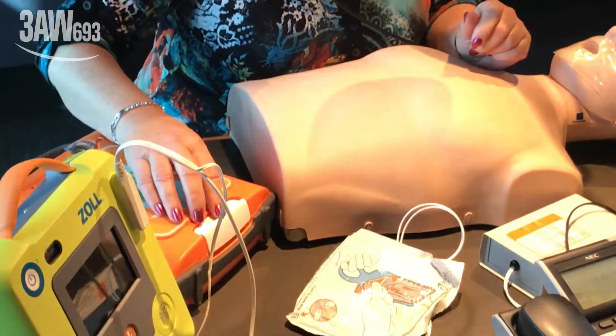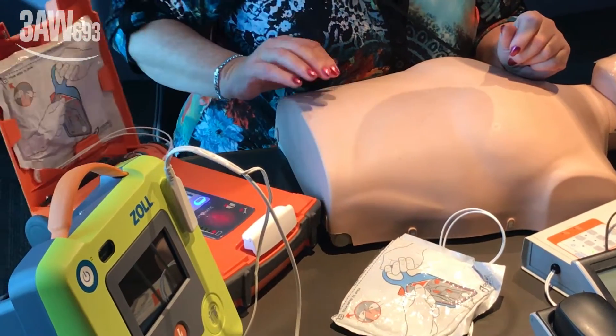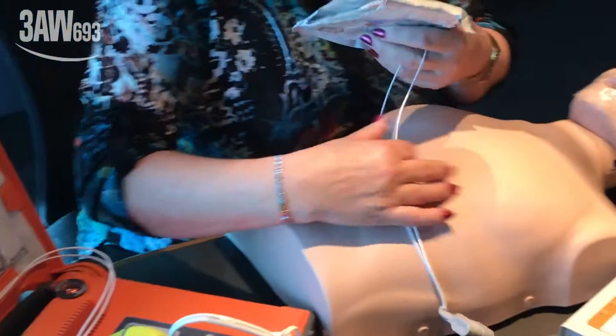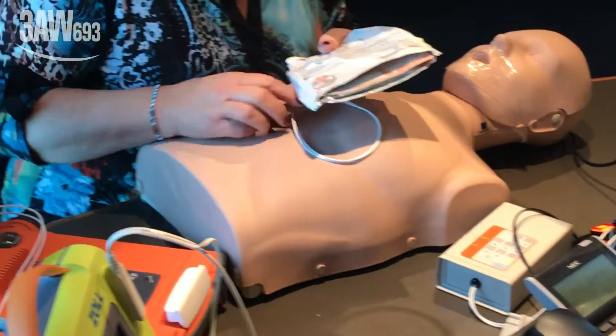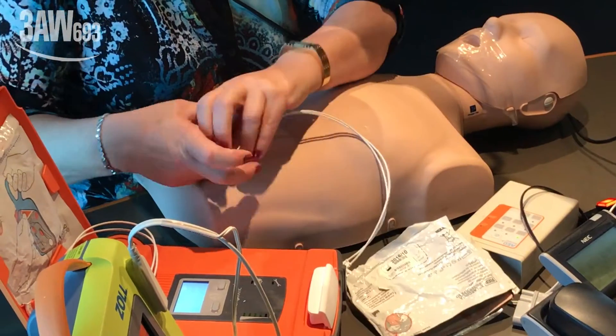A cardiac arrest has occurred. The defibrillator is brought to the patient and turned on — it just needs to boot up. The device says: 'Stay calm. Follow these instructions. Make sure triple zero is called now.'